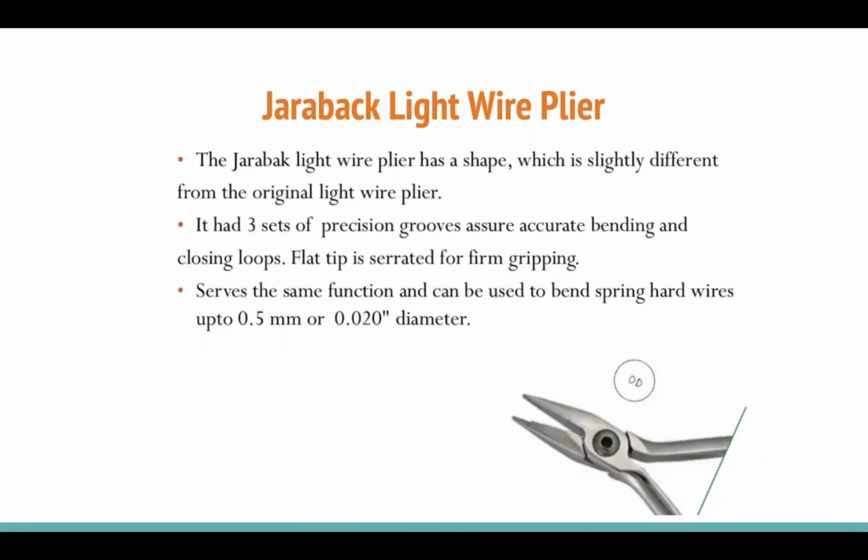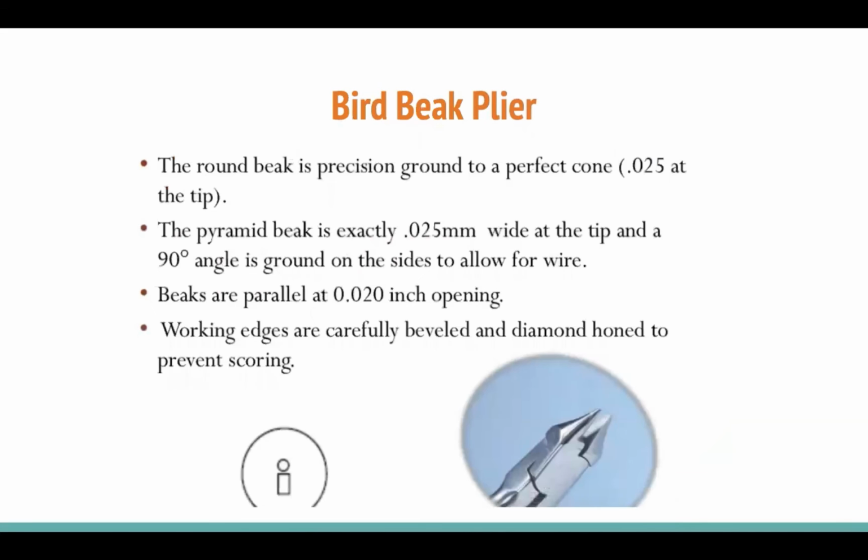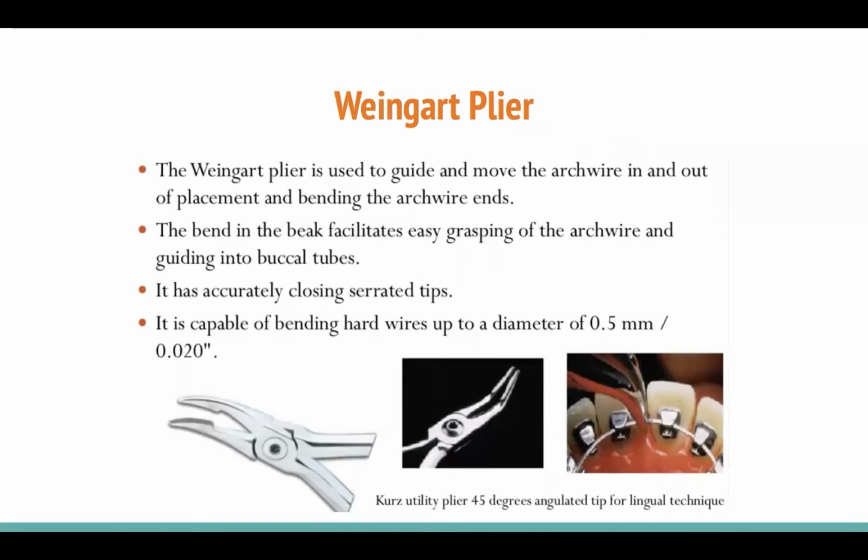So you can either buy the Jaraback wire plier or the standard light wire or the bird beak. You have a choice. You don't need all 3 varieties as a starter. Now, this is a very important plier which we use every day. It's called a Weingart Plier.